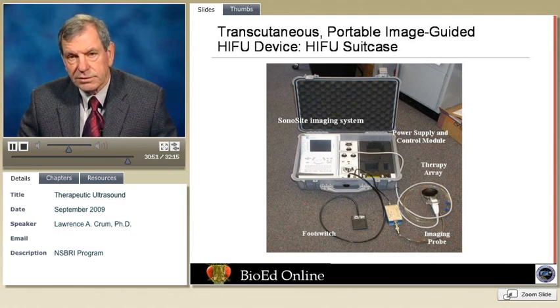We have tried to take these large devices, as big as an SUV and weighing almost as much, and reduce them in size so that we could build a system that we could take to the moon or Mars. And I show here an example of one system that we've reduced in size in our own laboratory. And this is now the size of a suitcase.